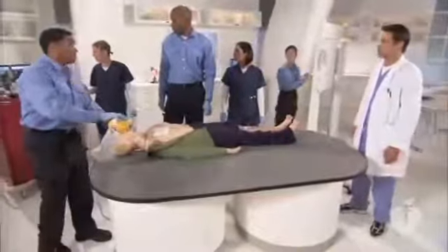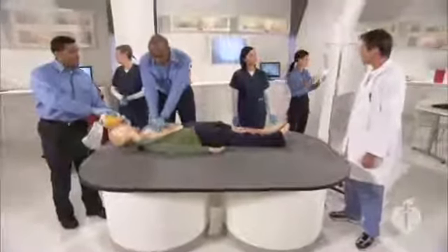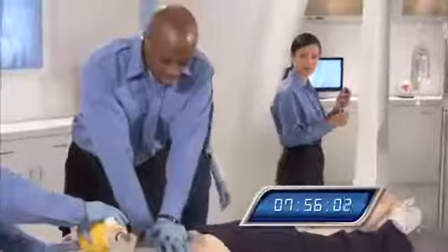Okay, the monitor shows sinus bradycardia. Do we have a pulse? I don't feel a pulse. Continue chest compressions. Continuing chest compressions. Shelley, how long has it been since our last dose of epinephrine? 3 minutes. Okay, Dana, let's go ahead and give 40 units of vasopressin. 40 units of vasopressin given. And the IO is flushed. Mandel, your compressions are slowing down. Can you pick up the pace a bit?